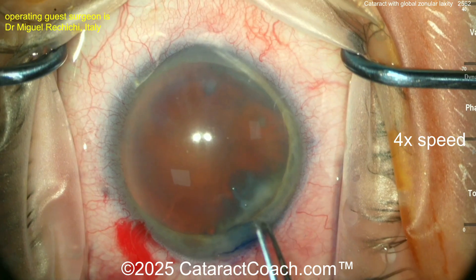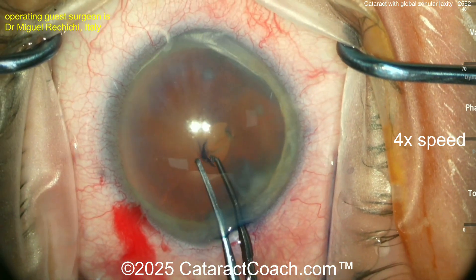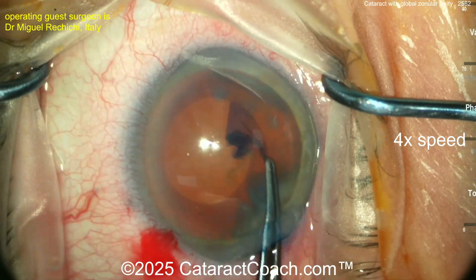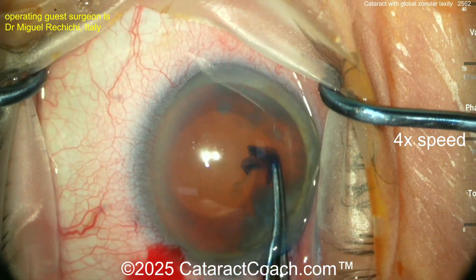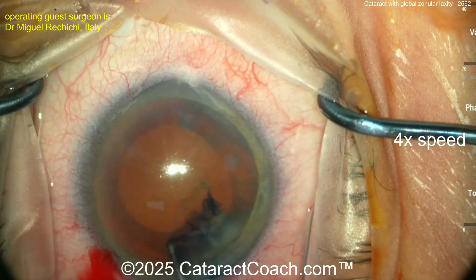Watch carefully here. The patient has overall zonular laxity. You can see there's a little bit of shaking or moving in the lens nucleus, but we're fortunately able to penetrate the lens capsule with just the forceps and achieve a pretty good-looking capsulorrhexis. Our guest surgeon here is Dr. Miguel Rechichi.